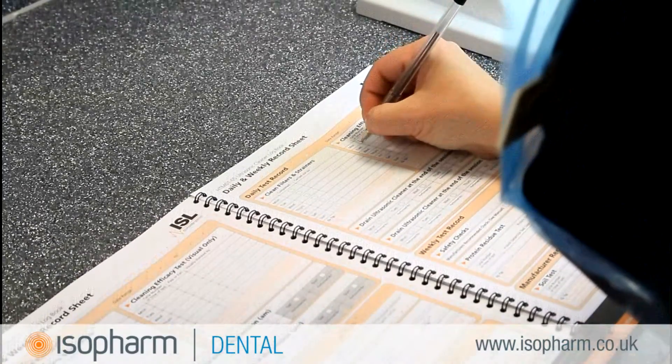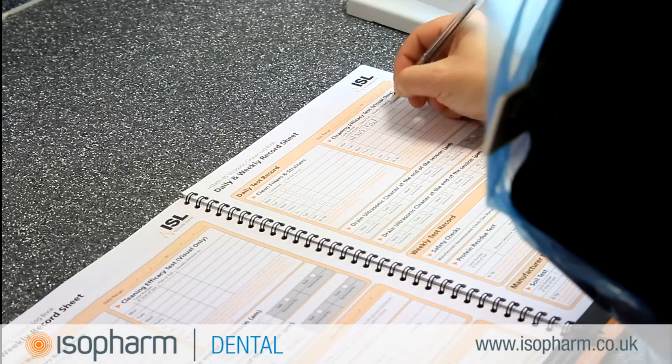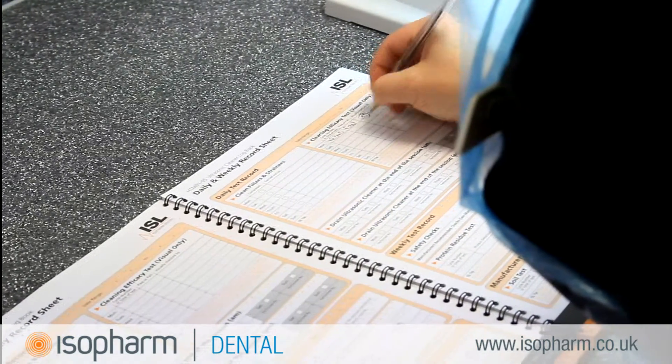The Isofarm range of logbooks provides you with all the record tables needed to comply. Record that you have performed the visual inspection in the daily record section.